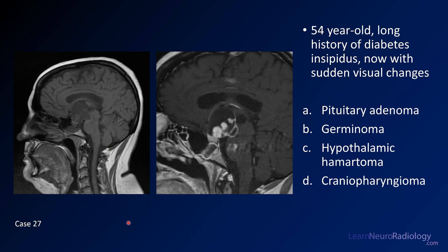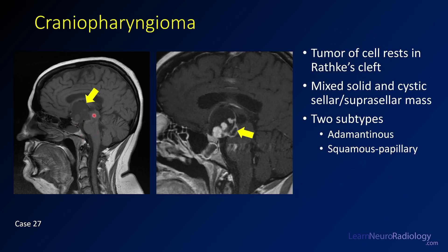Case number 27: a 54-year-old with history of diabetes insipidus, now with visual changes. Pre-contrast and post-contrast sagittal images. Choices are pituitary adenoma, germinoma, hypothalamic hamartoma, or craniopharyngioma. The answer is craniopharyngioma. There's a nodular, cystic mass in the suprasellar and hypothalamic region with avid enhancement mixed with cystic non-enhancing areas — a classic appearance. Craniopharyngiomas have two subtypes: the adamantinomatous subtype, which tends to occur in younger patients, and the squamous papillary type, which tends to occur in older patients. This is probably a squamous papillary one.